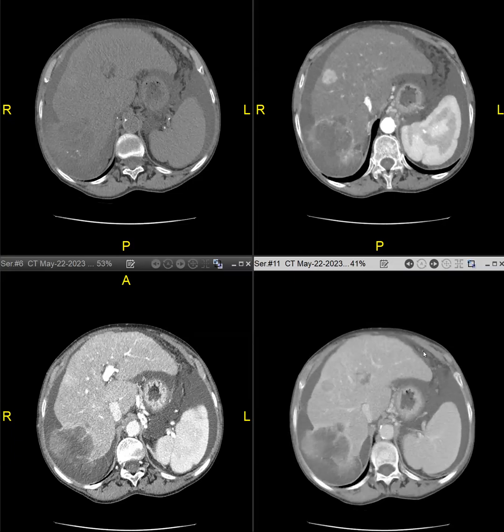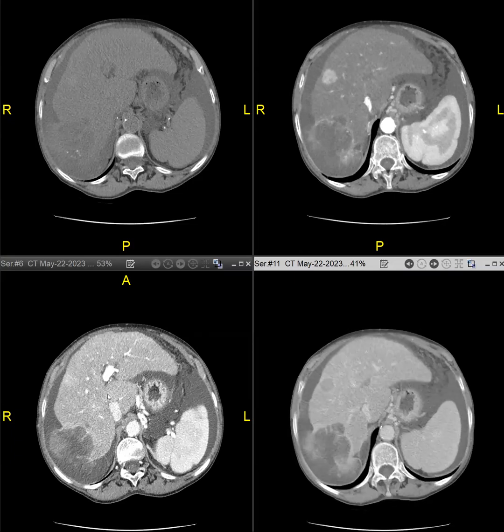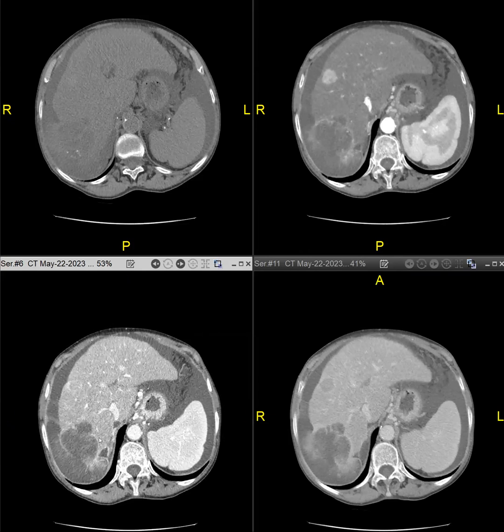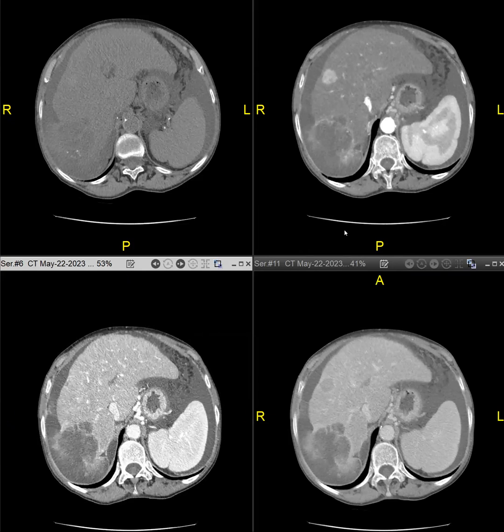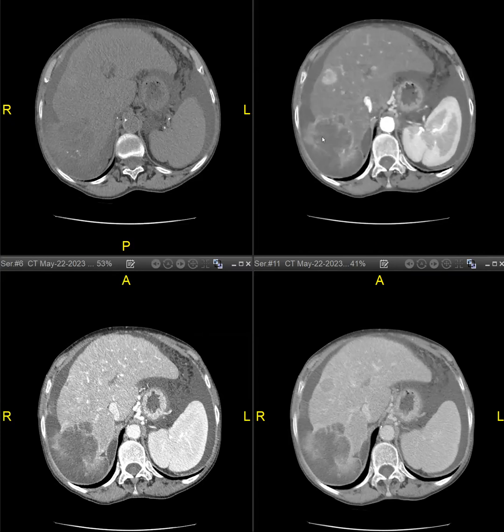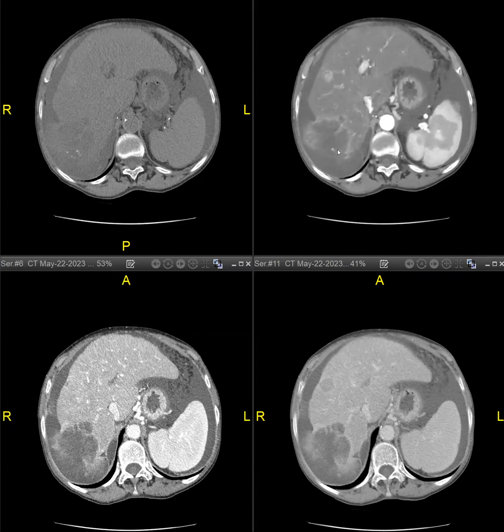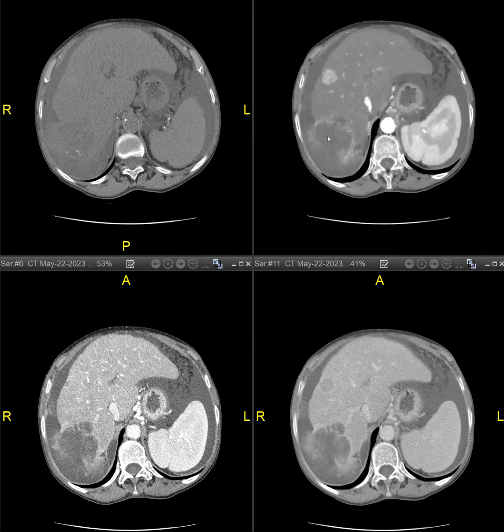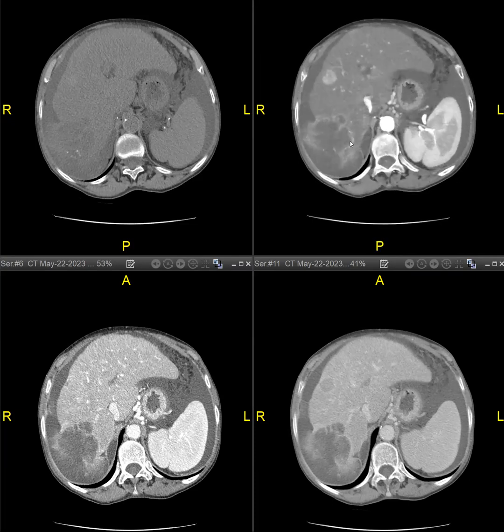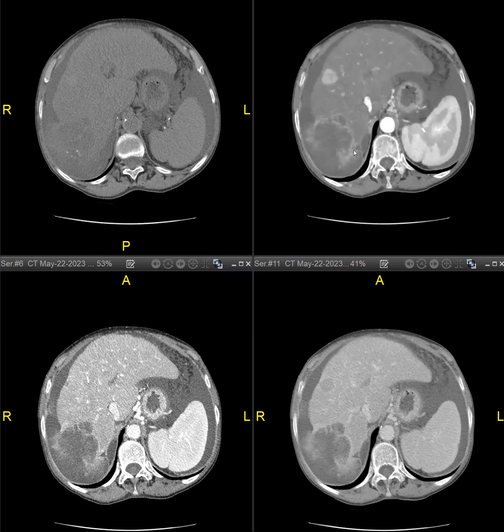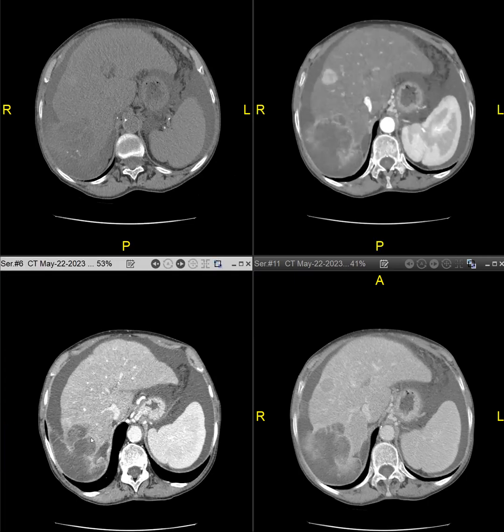There's ascites, and then there are several things in the liver. We see this very odd-looking mass on the right. It clearly broke through the capsule. It does have this peripheral rim hyper-enhancement, so that makes the categorization fairly easy.